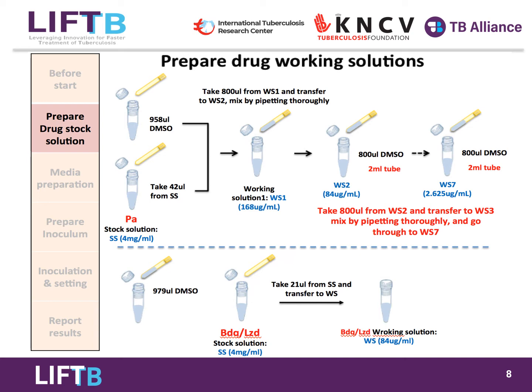To prepare the drug working solutions, you need to complete 2 different dilution processes, one for bedaquiline and linezolid, and another for pretomanide. This is necessary because critical concentration will be used as the test criteria for bedaquiline and linezolid, while the MIC will be used for pretomanide, as explained in slide 4.